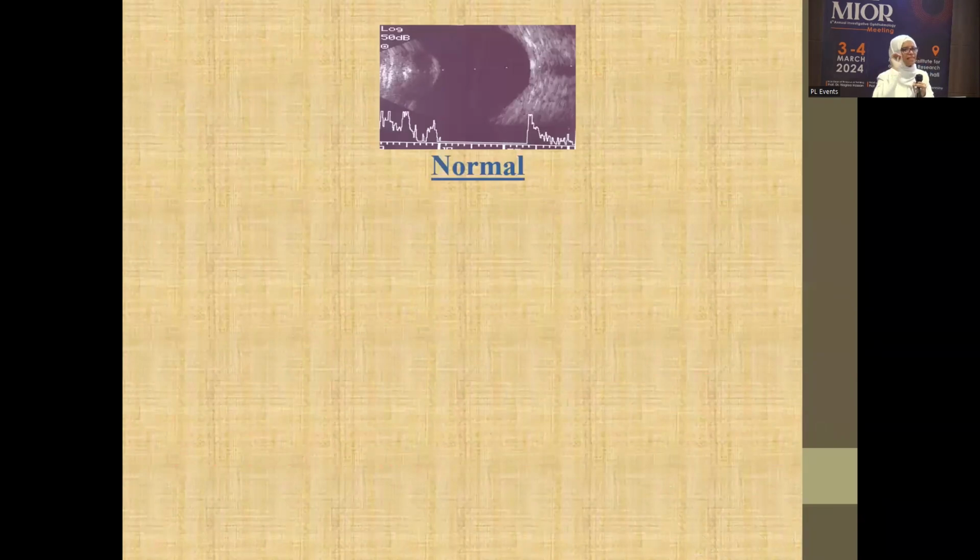This is the main important basics of ultrasonography: how to use the probe in different quadrants, how to adjust your position, which should be axial, taking with you the lens and the optic nerve, and finally how you can approach the macula through the marker.